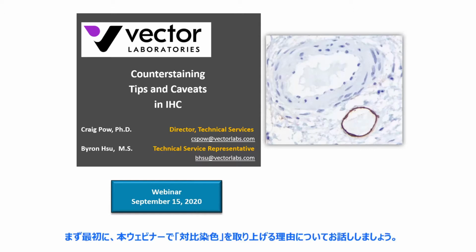Now, just before I commence the webinar, let me explain why we feel this topic about counterstaining is important enough for a webinar. As most of you know, the counterstaining procedure is conducted right at the end of the IHC, or immunohistochemistry, workflow. A lot of investigators work very hard to obtain the specimen, prepare the tissue, block it, cut it, and do the immunohistochemistry to get a good stain.